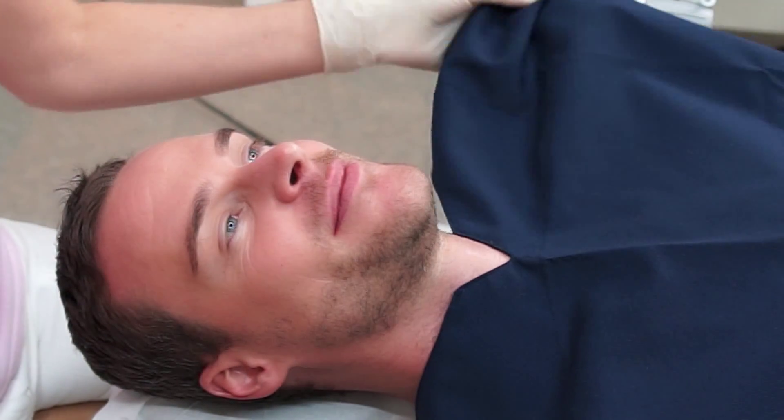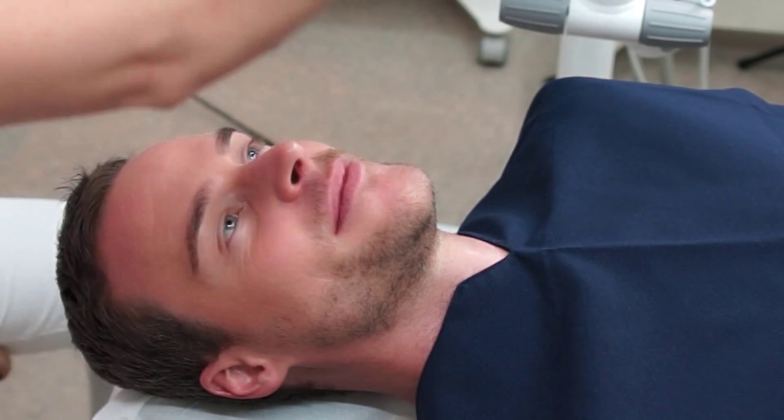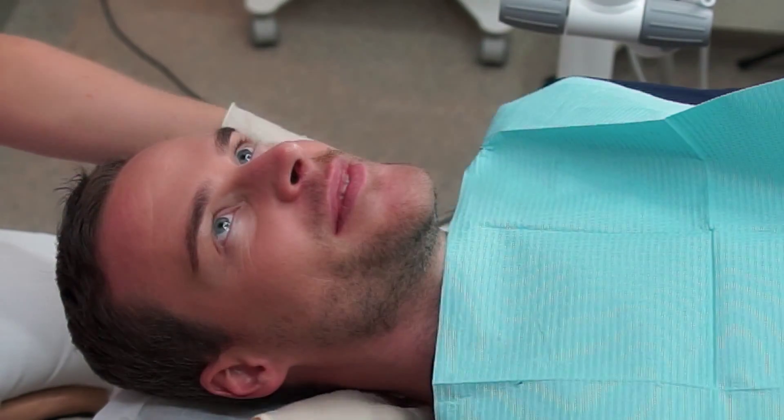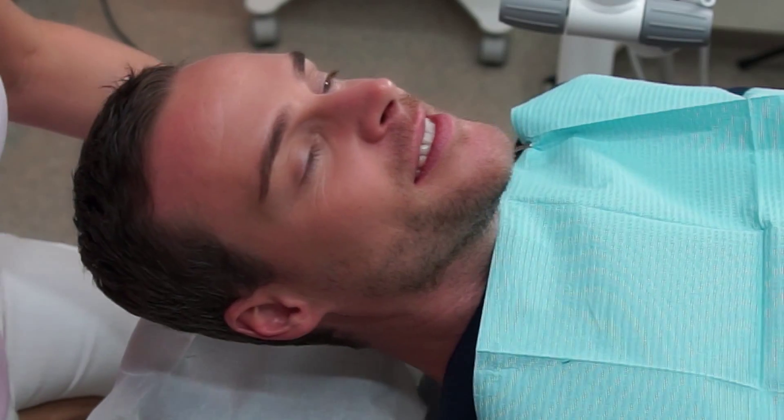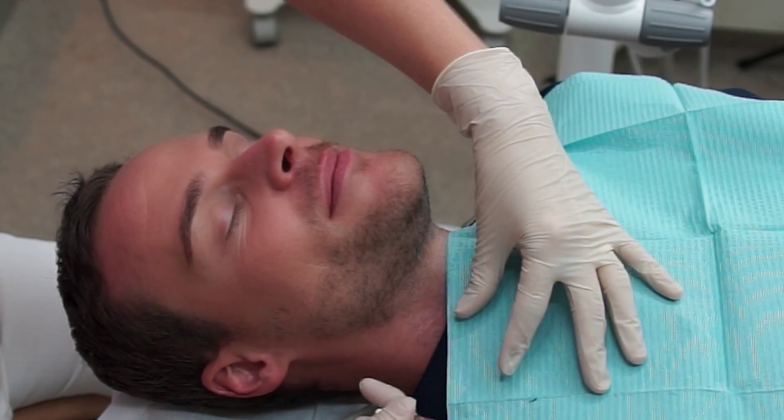Coming for a Zoom whitening session means that the dental hygienist will prepare the patient for the actual treatment of whitening the teeth. We know that with age, teeth become yellower. One of the reasons is as the enamel thins out.